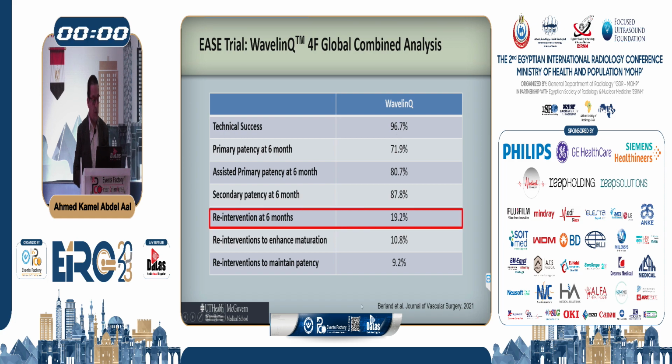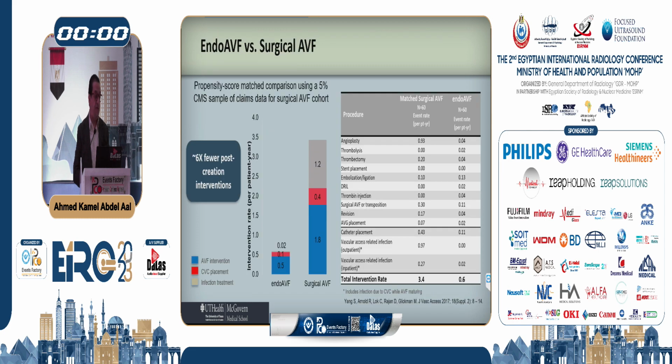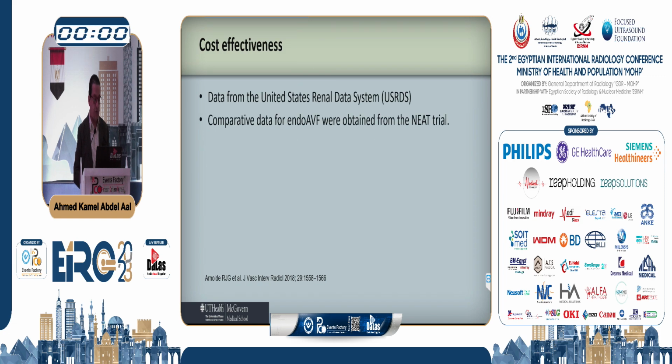I'm going to finish real quick in a second. So, cost effectiveness, because again, there is cost associated with this. It actually reduces your post-creation interventions 6 times compared to surgery, which is associated, in American dollars, with $11,000 cost savings for the first year. So it's actually a cost-saving device or technique.